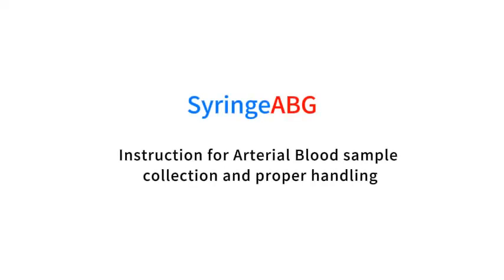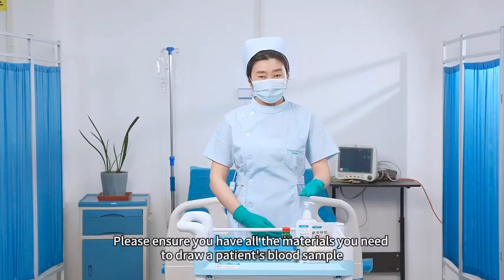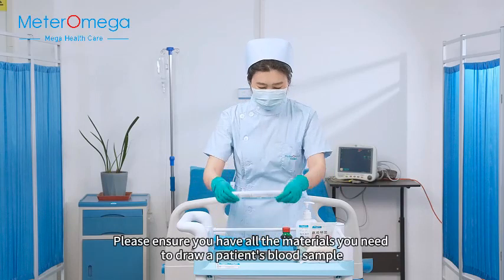Instruction for arterial blood sample collection and proper handling. Please ensure you have all the materials you need to draw a patient's blood sample.